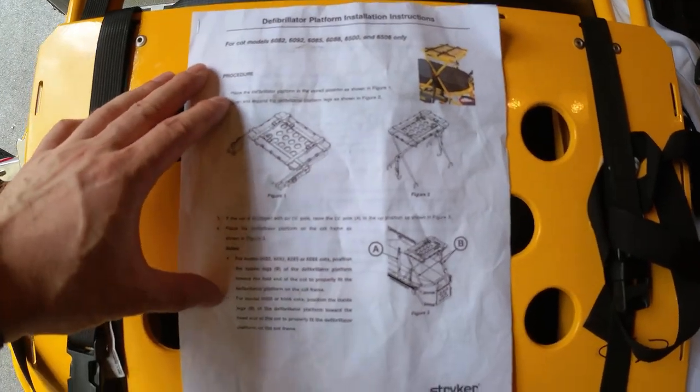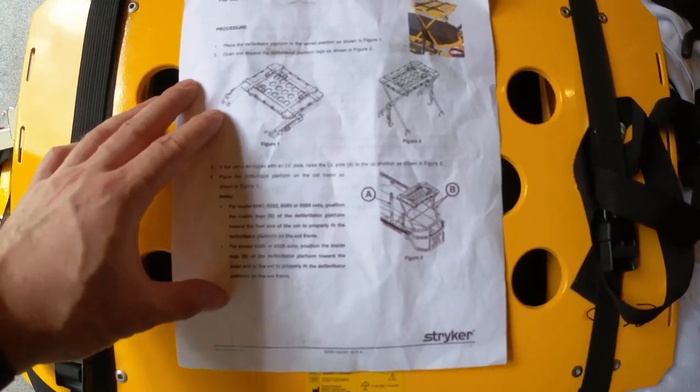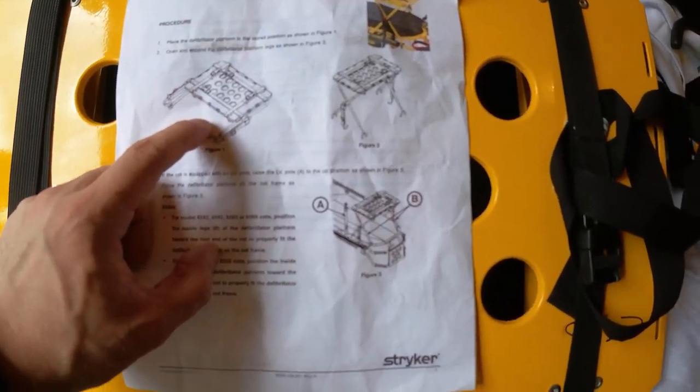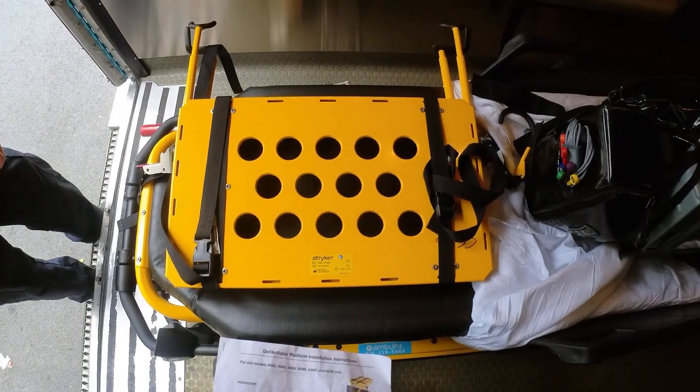This is the manufacturer's guidelines for this device. It's called the defibrillator platform — some people call it the tray. This is how it comes in the folded position, and when you unfold it, this is how it looks. This is the actual device I'm demonstrating on the stretcher.